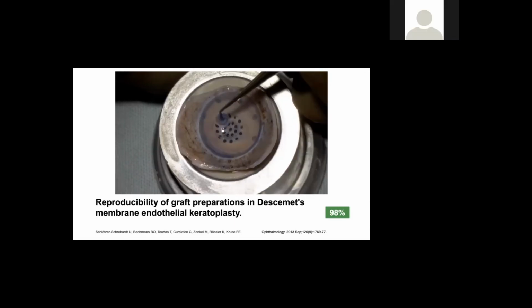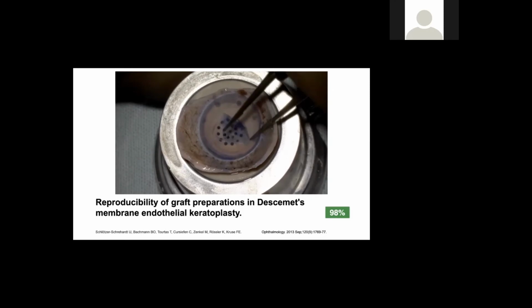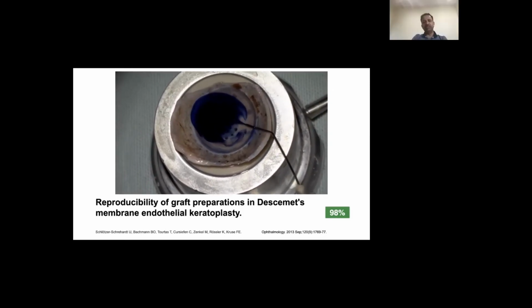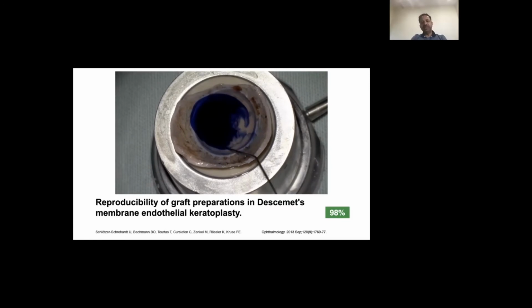The tissue wastage rate is in the range of about 1 to 2%, but even if you damage the donor cornea, the donor DM, the tissues can still be used. You can use either an eccentric trephination, or you can use trephination of a smaller diameter. And Kashif has also done a lot of hemi-DMEK, so he knows how to work with smaller size donor grafts as well.